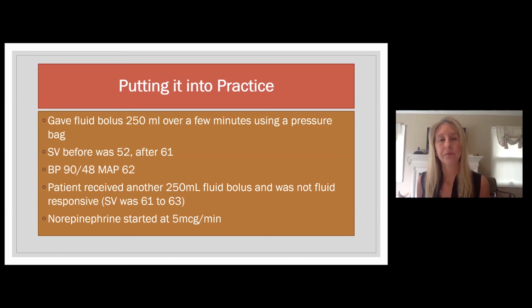And I highlight this COVID patient because with all of our COVID patients, this was new territory for us and new ground. And these patients were very sick, the ones we had, as I'm sure yours were as well. And I wanted all of the information I could get. And part of that information for me was the hemodynamic parameters. And we were able to utilize that to guide care with these patients.